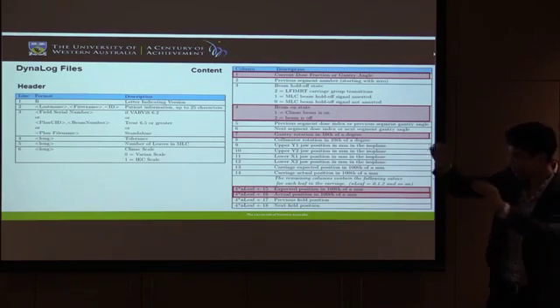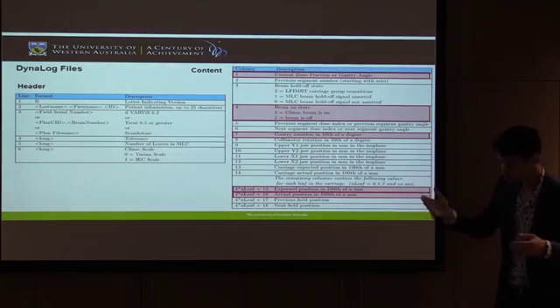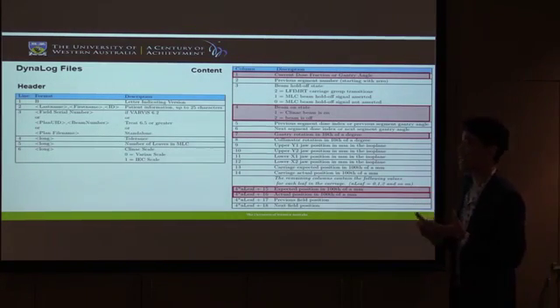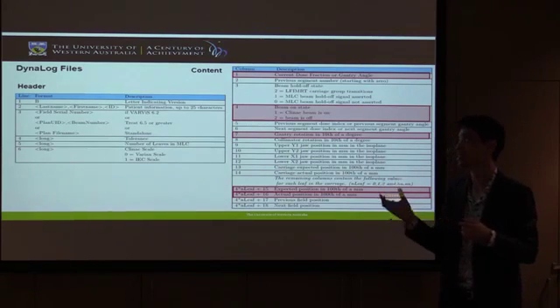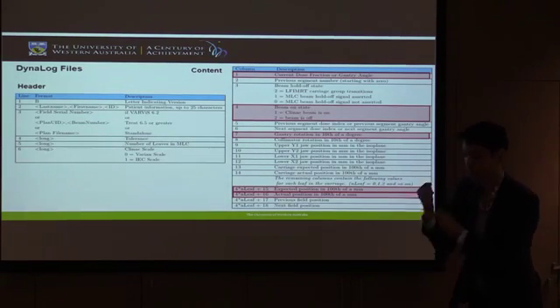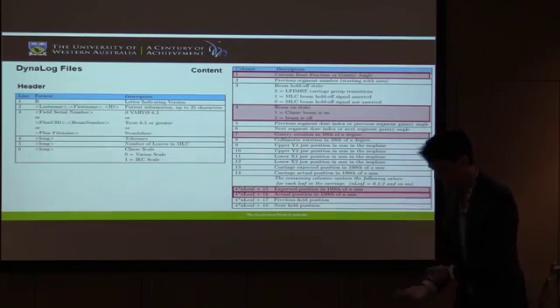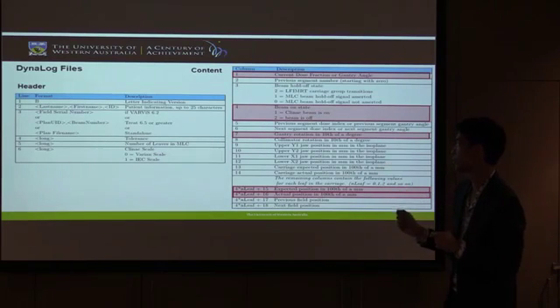So you've got the first 6 lines, and then the 7th line is the first line of content. The 7th line is the first time step, the first 50 millisecond time step. The second 50 millisecond time step is appended underneath, on line 8, and then you just keep on appending lines of information until the treatment ends, the delivery stops.